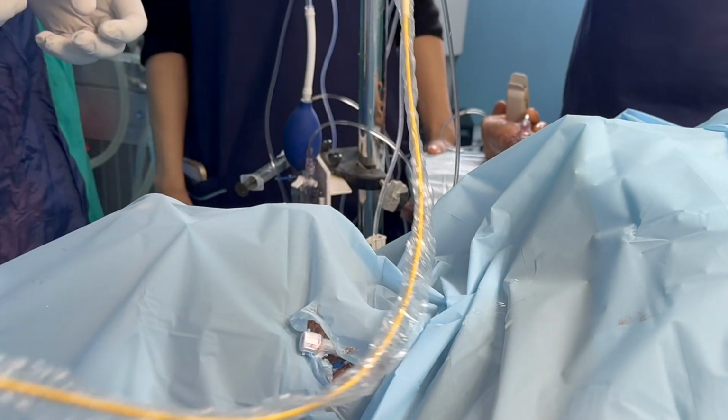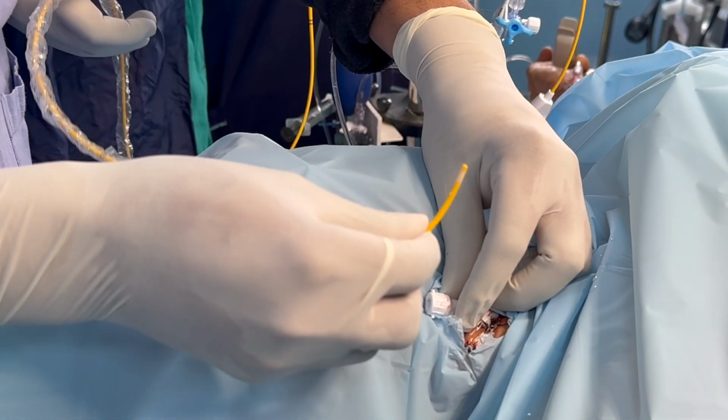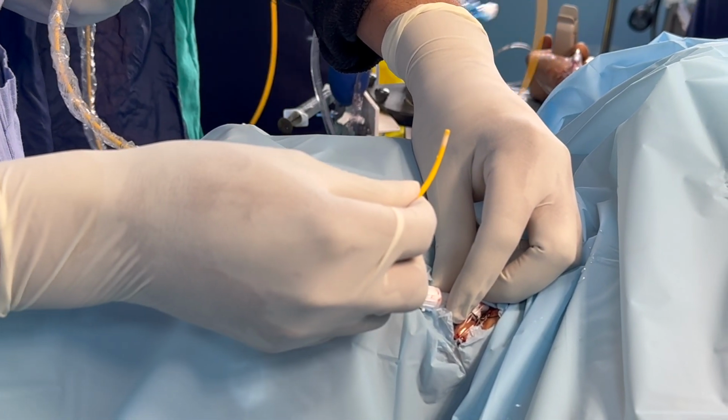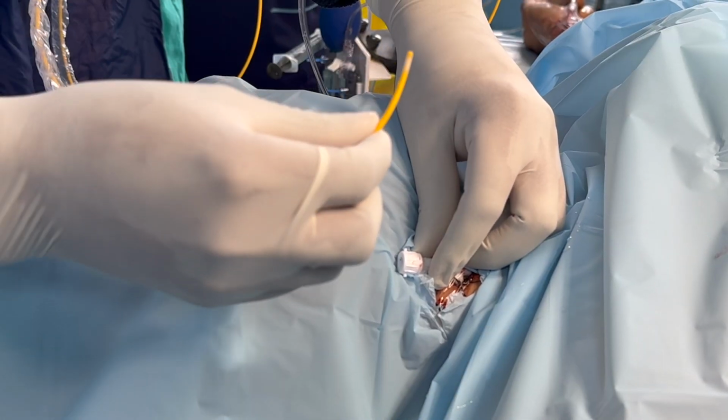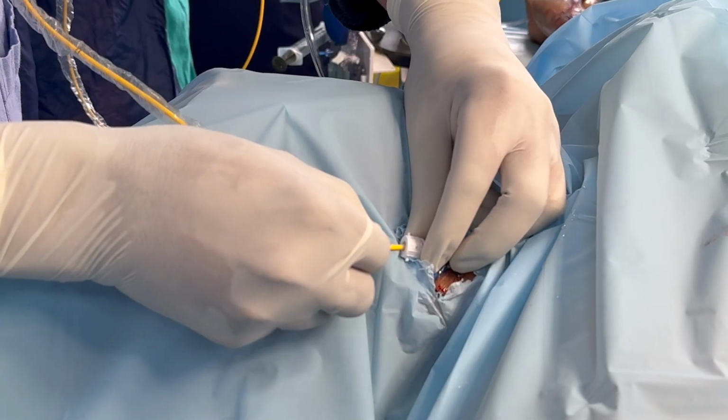Let's focus on this side. We have to insert this PA catheter in the 11 o'clock position, so not in 12 or 1. Okay, so in the 11 o'clock position.